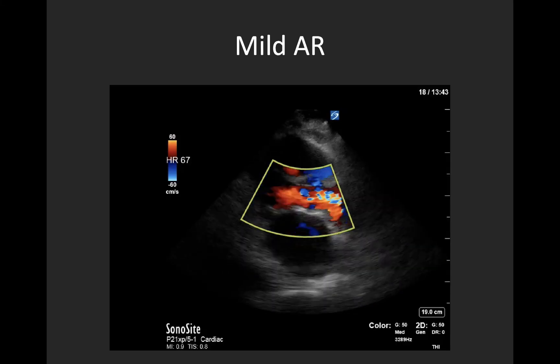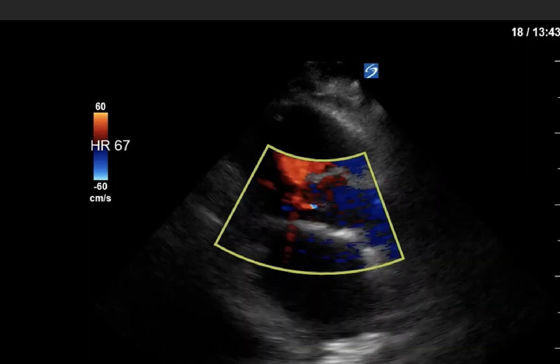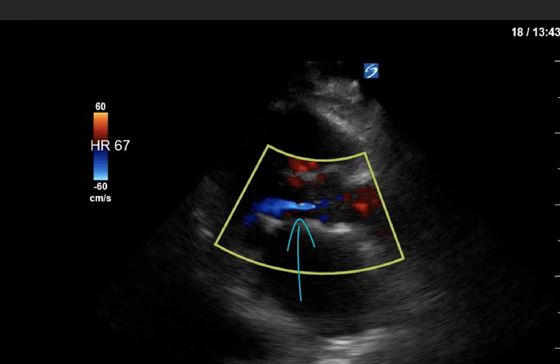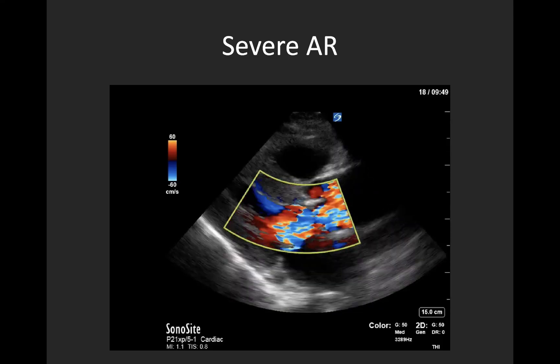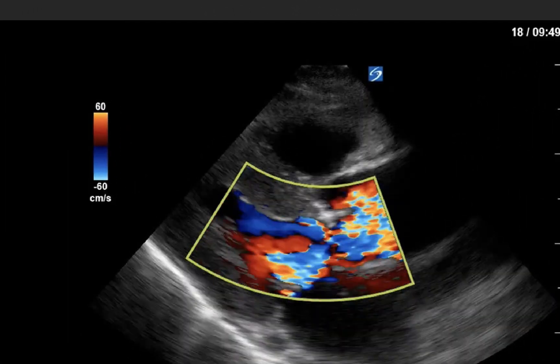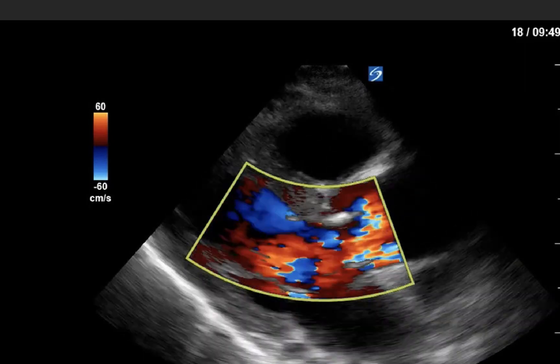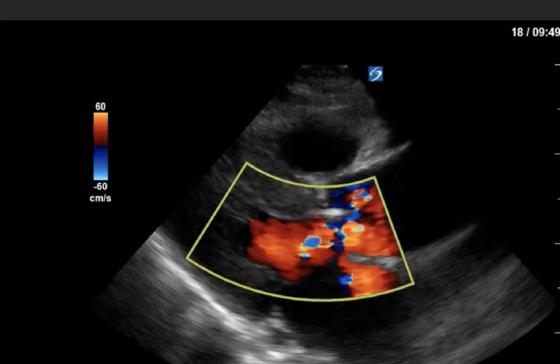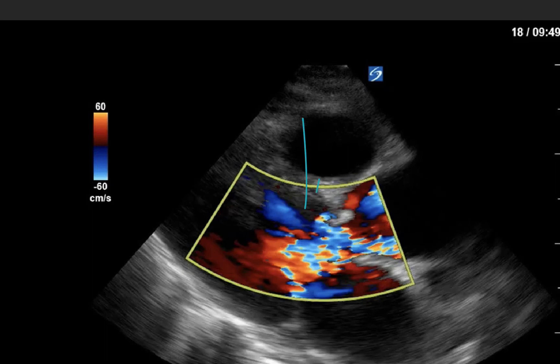Here we have an example of mild aortic regurgitation in a parasternal long axis view — that thin little blue jet in diastole in the LVOT. Slowing down your clip or freezing and scrolling to identify the regurgitant jet can be quite helpful. This next clip is an example of severe aortic regurgitation, again in a parasternal long axis view, and it can be hard to see, especially in tachycardic patients when there's so much high velocity flow. As I've frozen the clip here, you can see this large blue aliased jet occupying most of the LVOT, consistent with severe aortic regurgitation.